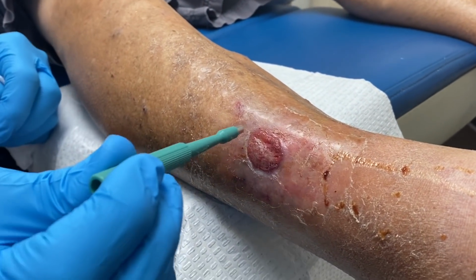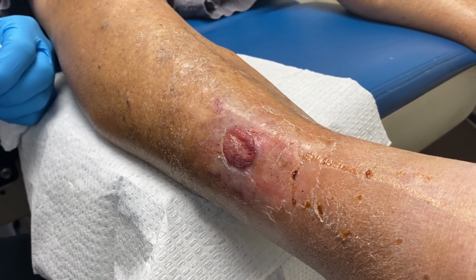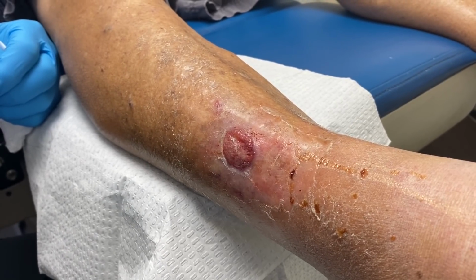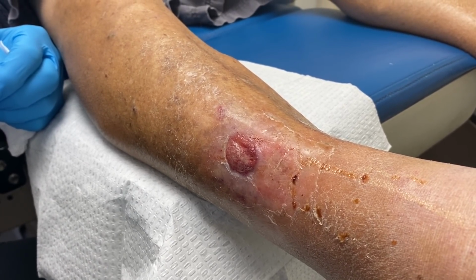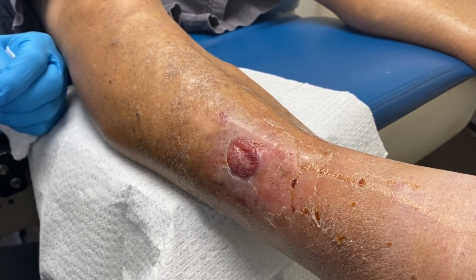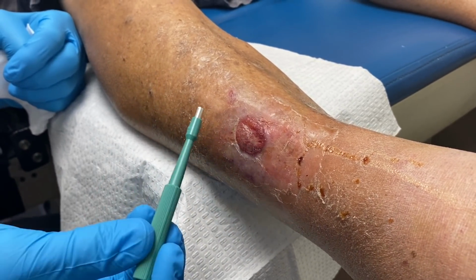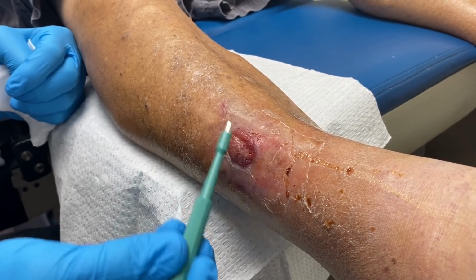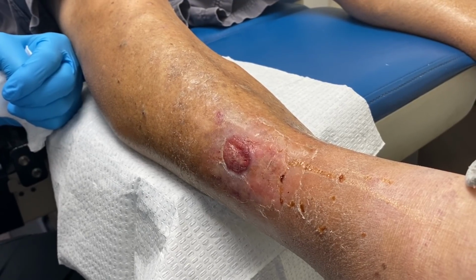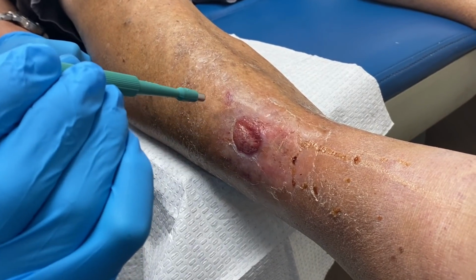And we've already infiltrated the area with a little local anesthesia with epinephrine. The only time that I will mention the word epinephrine is when we perform biopsies, because they bleed a lot, especially these lesions that are raised, that are granular, which means that they're beefy looking. They're very vascular. Okay, so Caesar, you got it?